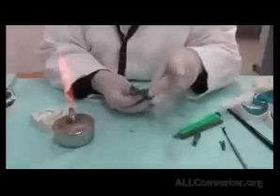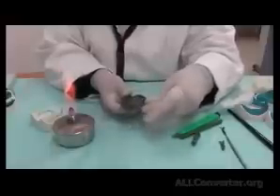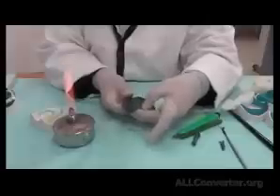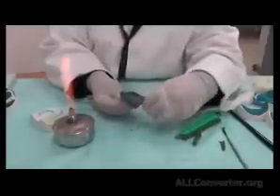It's not looking beautiful, but once more I heat it, cool it down a bit with warm water, mold it with my fingers, removing all of the excess, gathering the material by my fingers, spreading it, not in the mid part. I tried in the mid part to keep the fitting surface free of material. I spread it only on both sides of the raphe, not in the middle. In the middle I'm trying to reduce the amount of material on the fitting surface. So this is the compressible area, ready to be loaded in the patient's mouth.